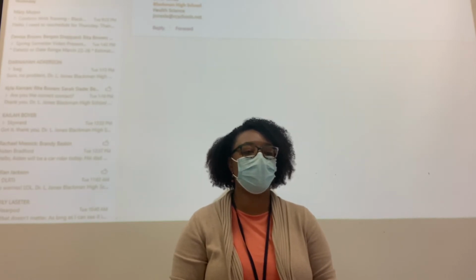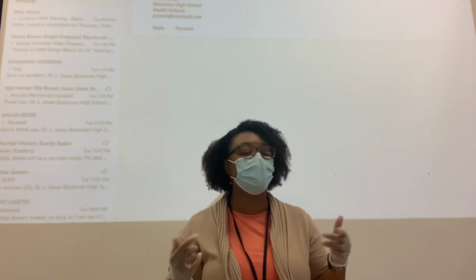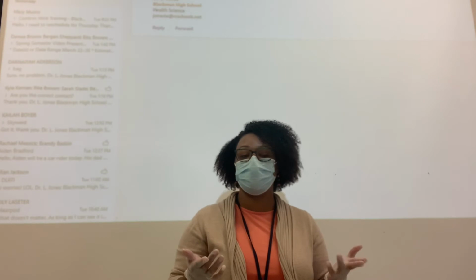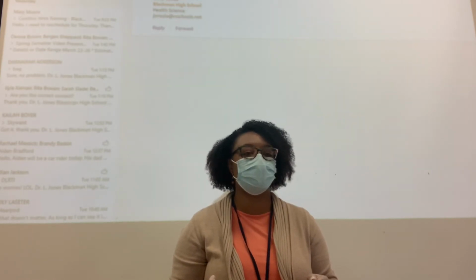All right, so get the blood pressure cuff and stethoscope. So guys, listen, when you are working in the hospital, most likely you're gonna have to pull your hair up, pull it back so that it's not getting in your patient's face, okay? But I know right now we're doing teaching purposes in school. So, do you have something pulled back there? Oh, she's prepared over here. All right, so put the stethoscope around your neck. And then get the blood pressure cuff so that you can wrap it on my arm.